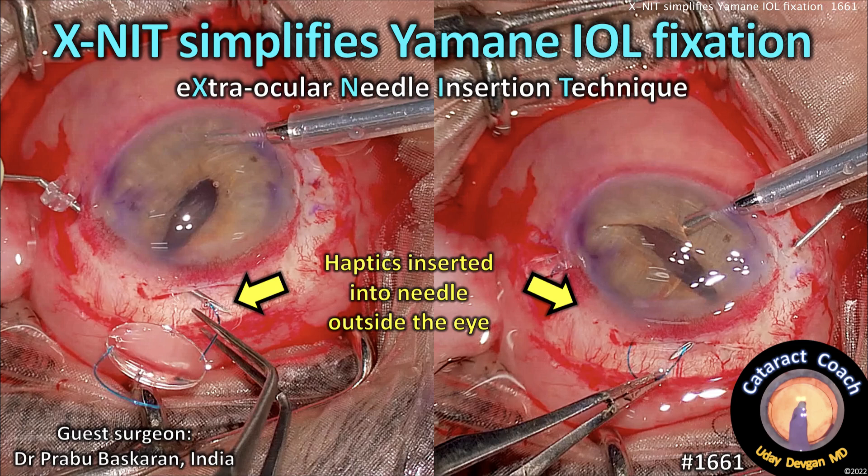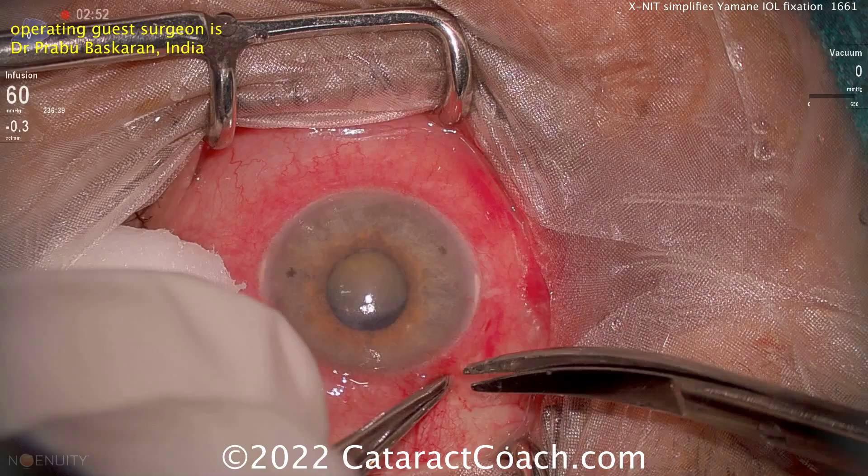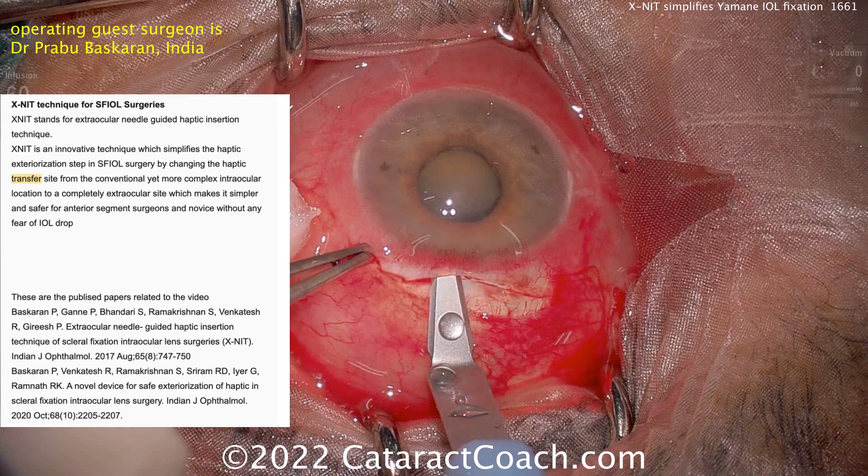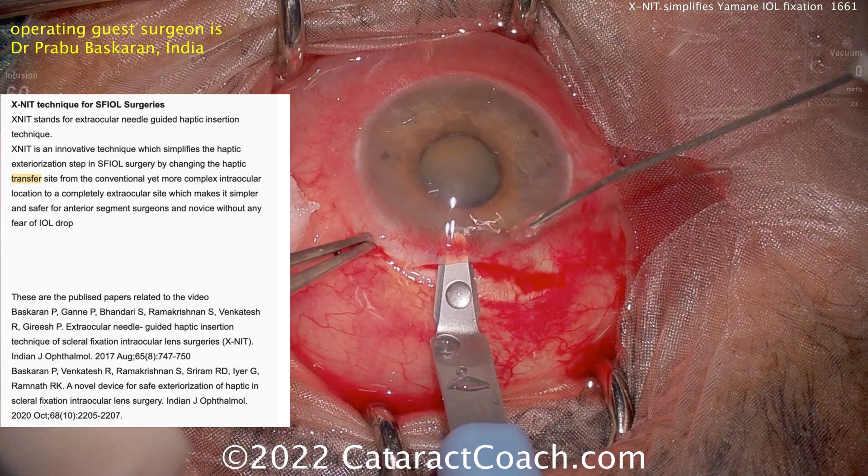ExNIT simplifies Yamane scleral fixation. That stands for Extraocular Needle Guided Haptic Insertion Technique. This technique, which has been published, allows you to basically engage both haptics with the needle for the Yamane technique outside the eye.